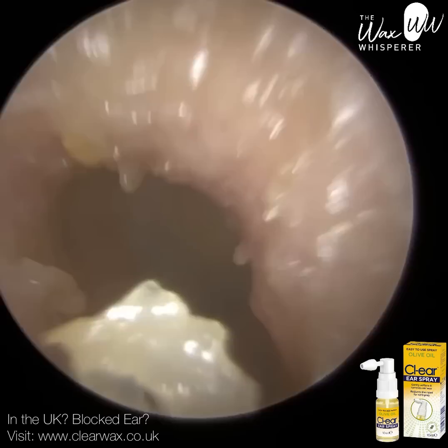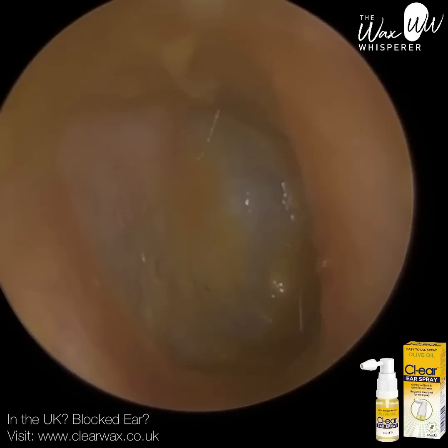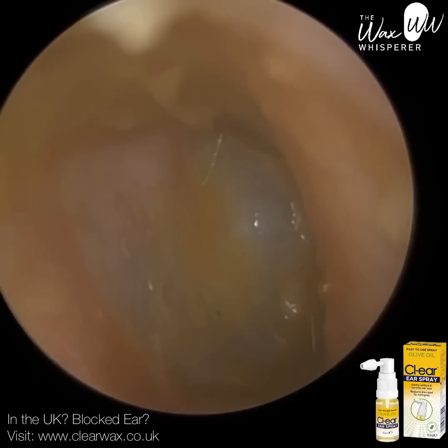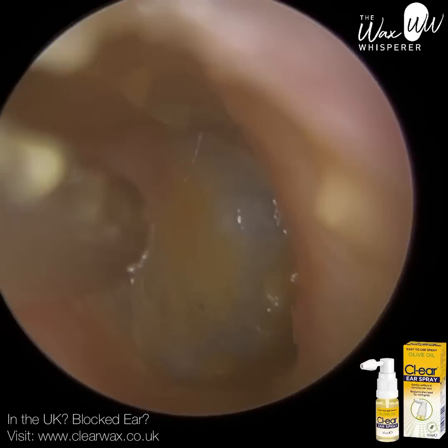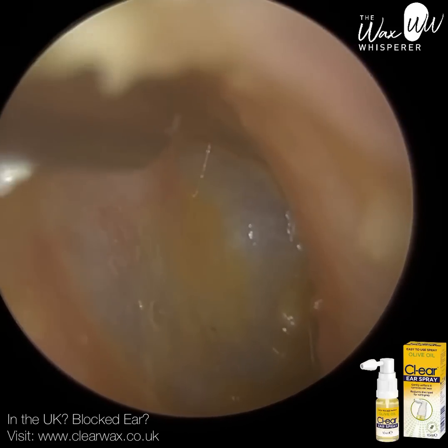The first time I saw this patient, it was really, really difficult. I had to put drops in quite a lot during the procedure, and we did manage to remove it, but it was a long, really long session. And today it was less than five minutes, so the drops really, really did help.